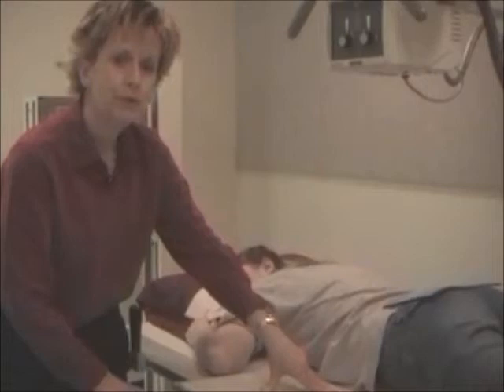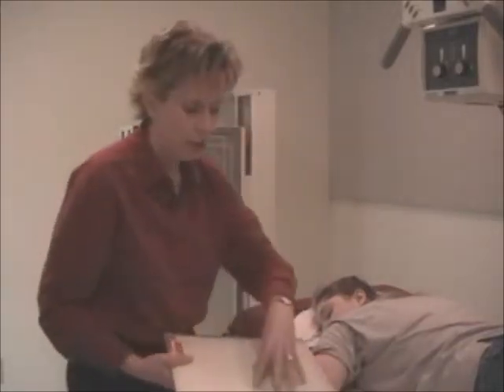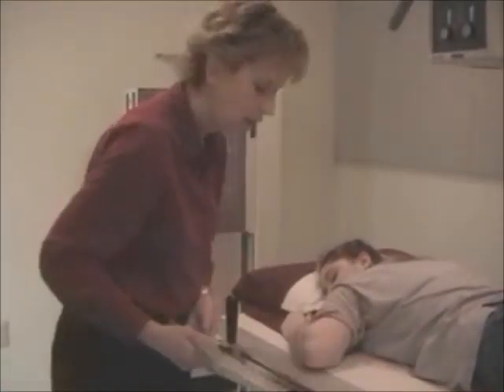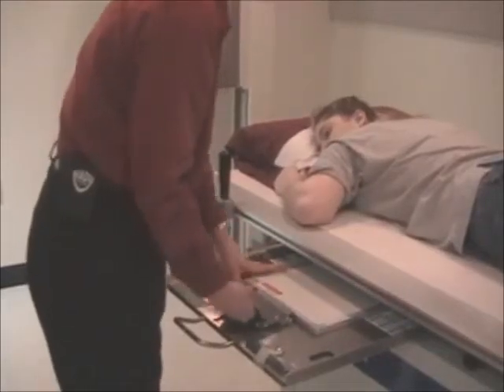Well, if you were to recognize the fact that say 80% of pathological conditions happen in the pyloric region, that's the area you want to protect. You want to put the ID blocker towards the fundus then. You want to keep the pyloric region free of possible obstacles. That's our rationale for putting the ID blocker towards you as the technologist.